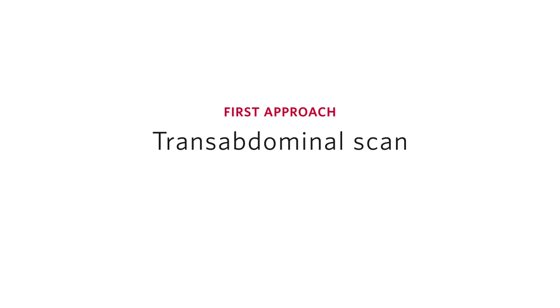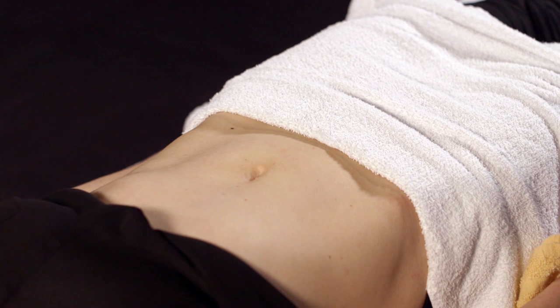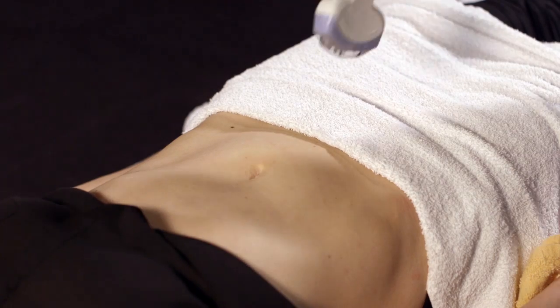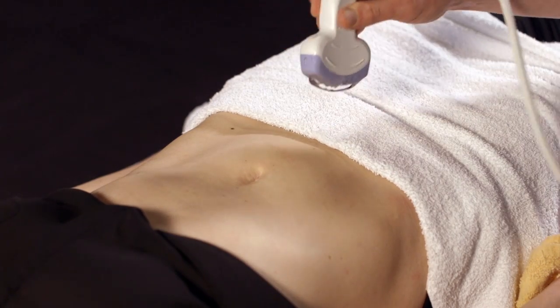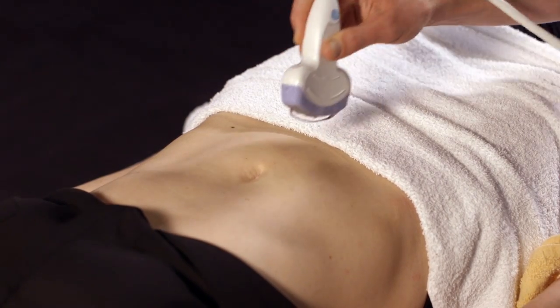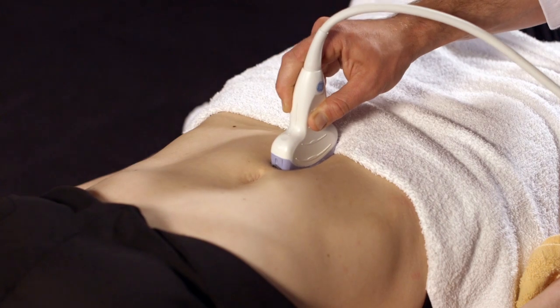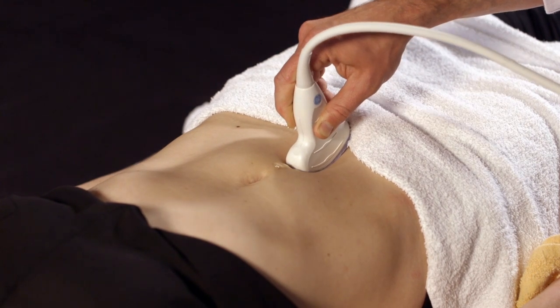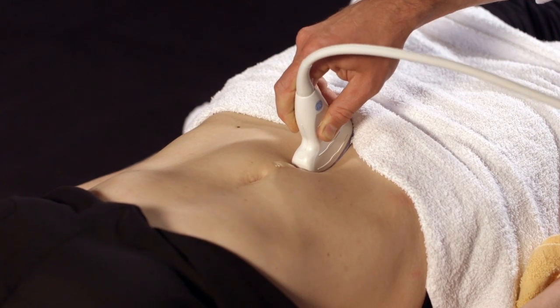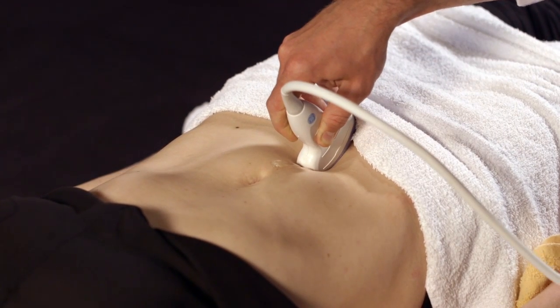Always start with the transabdominal approach first. To do this scan, a full bladder is essential to provide an acoustic window into the uterus. Start by holding the curved array probe, also known as the abdominal probe, in longitudinal orientation. The indicator should point to the patient's head. Place the probe immediately above the pubic symphysis.